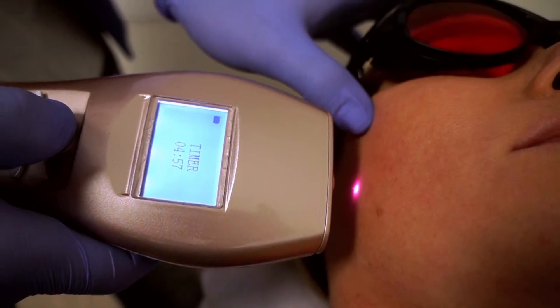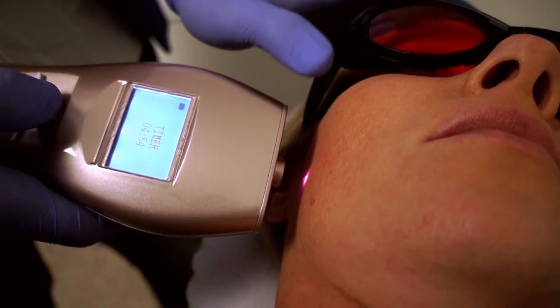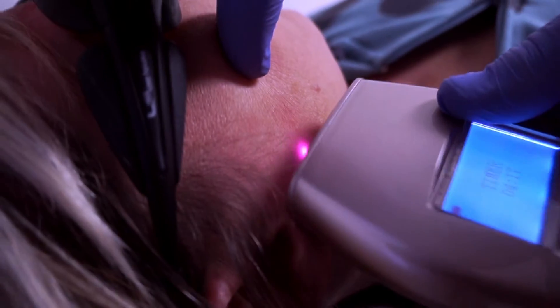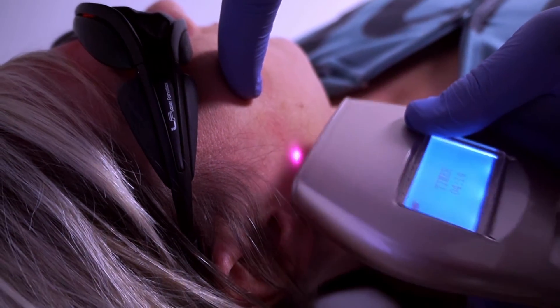Hold the laser device right over the pain, one half inch over the area to treat. Move the laser in circular motions. The laser should always be in motion.